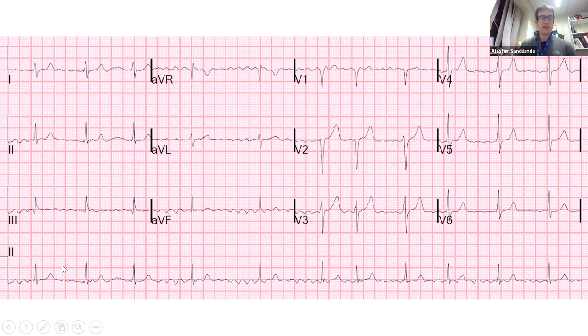Okay, so this is possibly atrial fibrillation. And this is when we do see fibrillatory activity occur, that's a T wave, that's another T wave, but there's fibrillation going on all the time, conducting to the ventricle, QRS, T wave. So you can see this fibrillatory activity, it's not flat, because every bit doesn't look the same. And again, in V1, you can see this fibrillation activity. So irregular rhythm, atrial fibrillation.